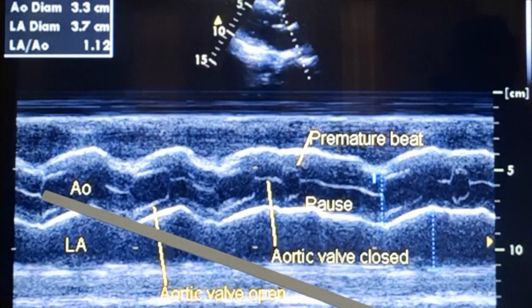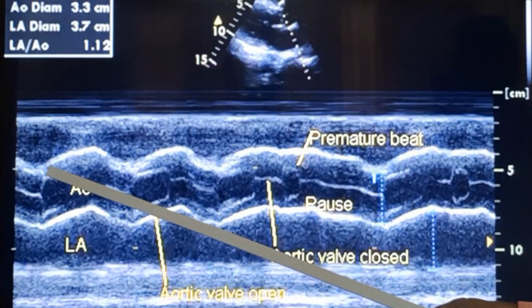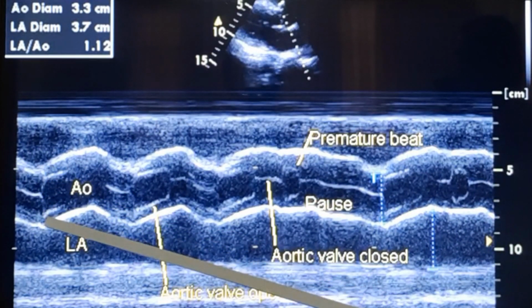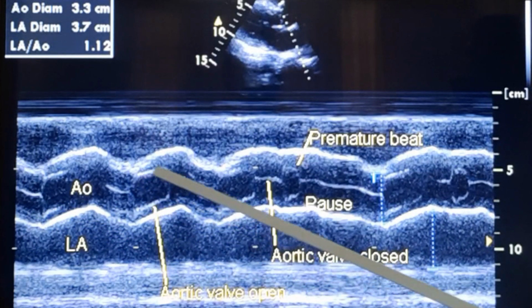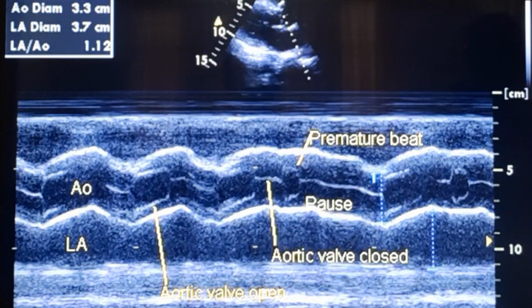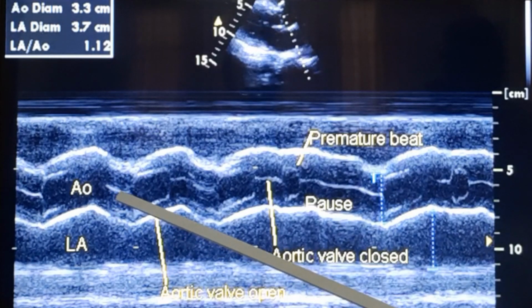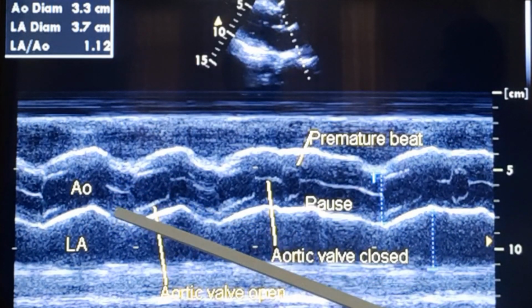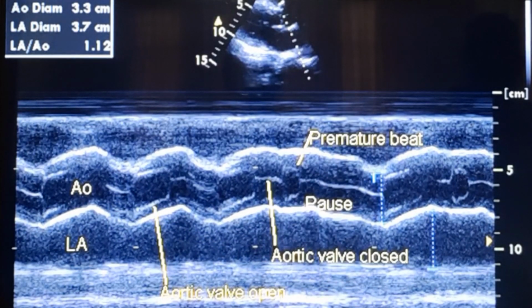During systole, one opening motion is seen towards the anterior aortic wall and another motion is seen towards the posterior aortic wall. It forms almost a box or rhomboid shape. That is the normal aortic valve opening seen on echocardiogram, and the closure line is central. You can see the distance from both aortic walls is almost the same.